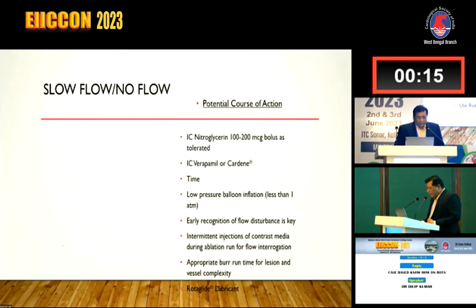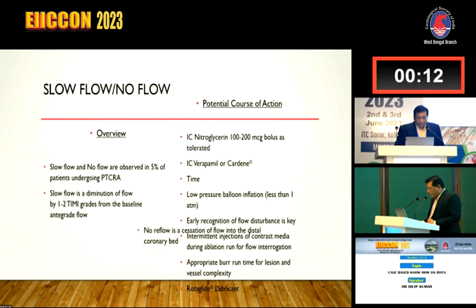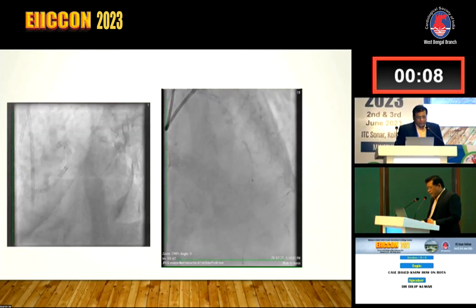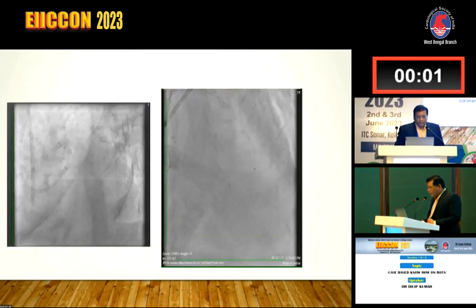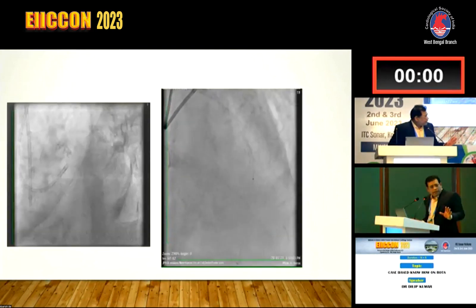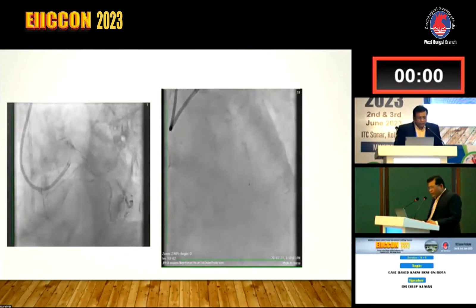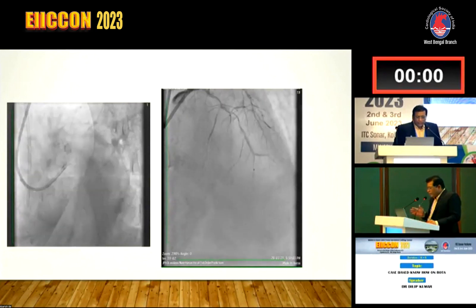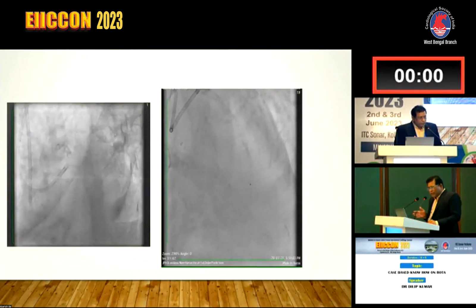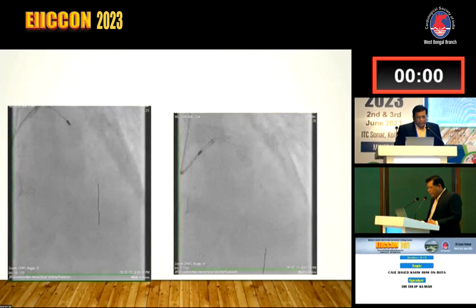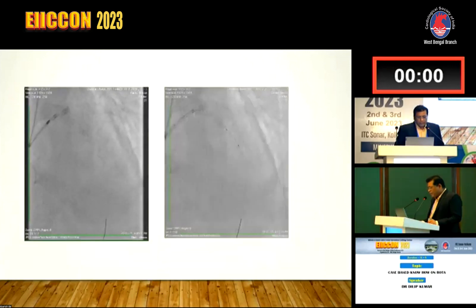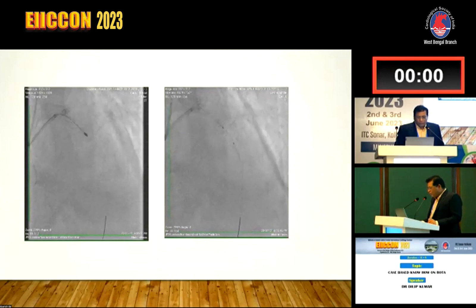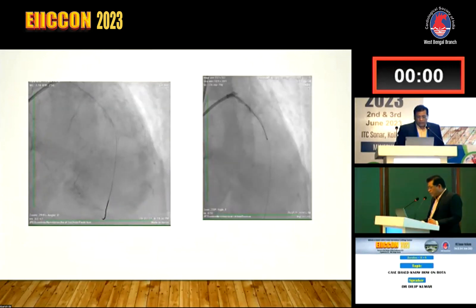Here is a case - a hugely calcified LAD lesion right from the ostium to the mid LAD. Can anyone comment which calcium modification tool can work here? I don't think besides rota anything can fit here. After the initial run we crossed through, there was a polishing run, and then finally it was dilated with NC balloons and stented with a good result. This was not at all a case for bypass surgery.